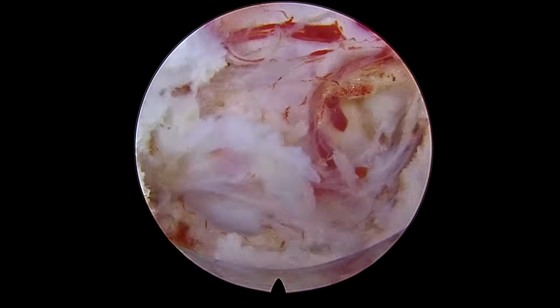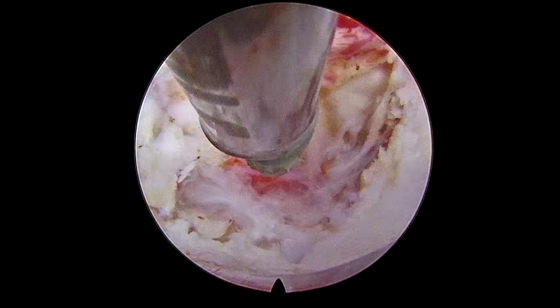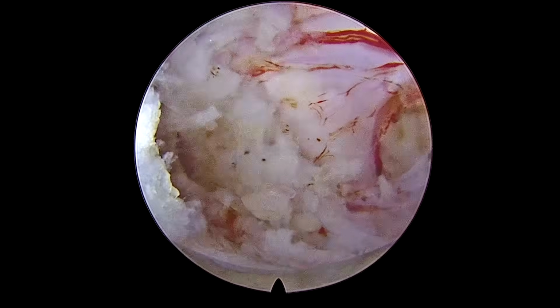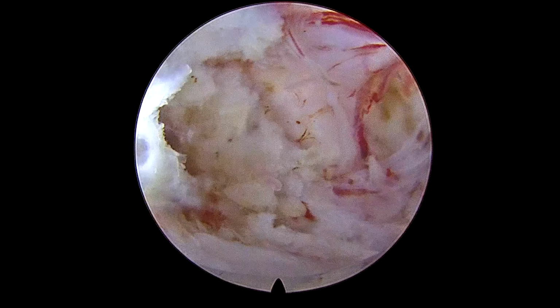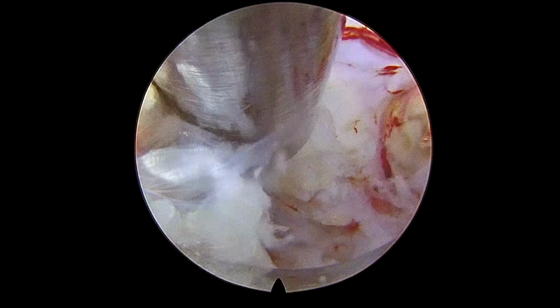So at this stage you can clearly see the axilla of the root here. I am just burning the vessels in the axilla. You can already see the disc fragment which was lying in the axilla. But now we have to expose the shoulder area as well. So we'll move upwards, remove those soft tissues and the remainder of the ligamentum flavum, and we'll expose the shoulder area as well.